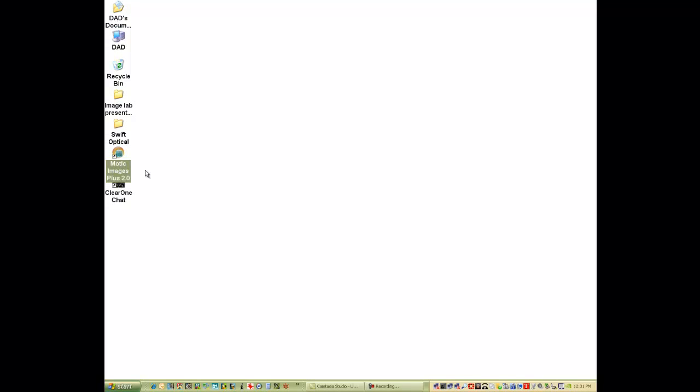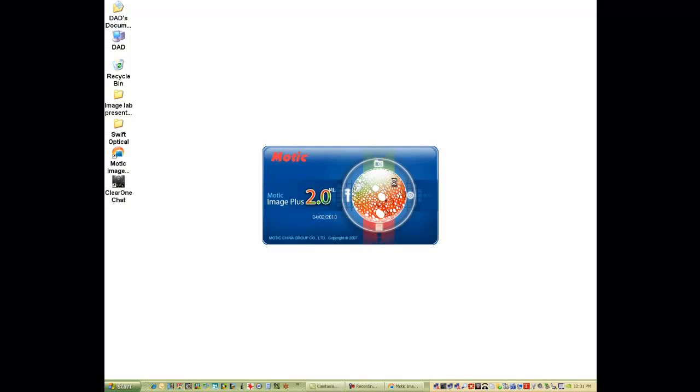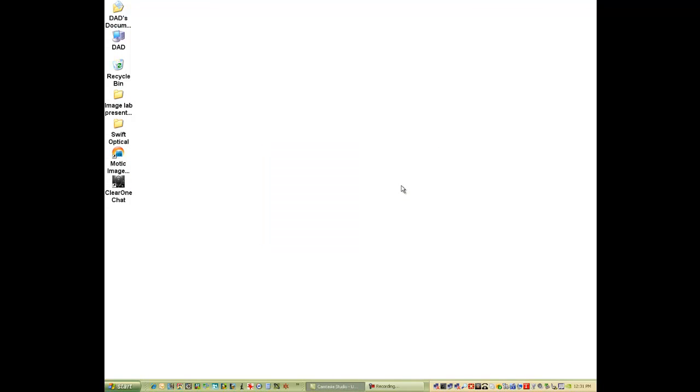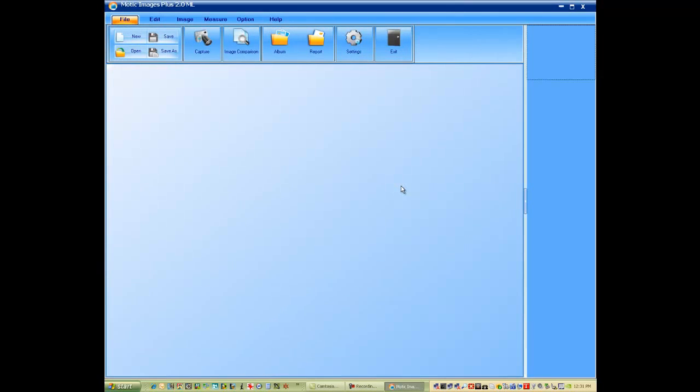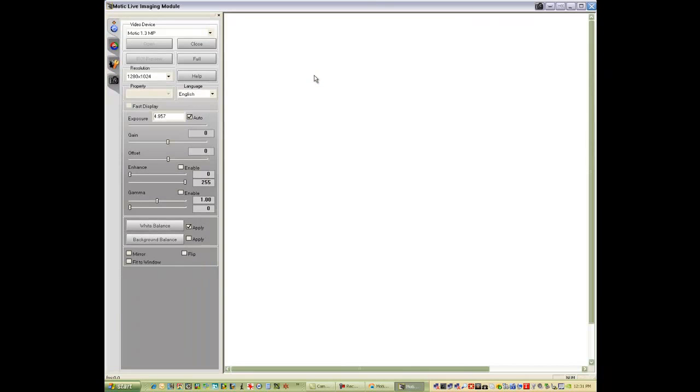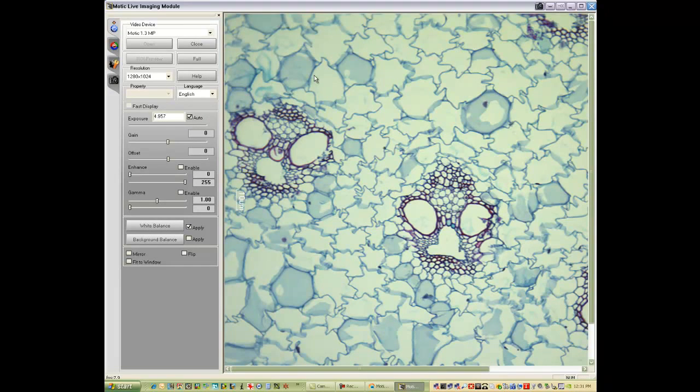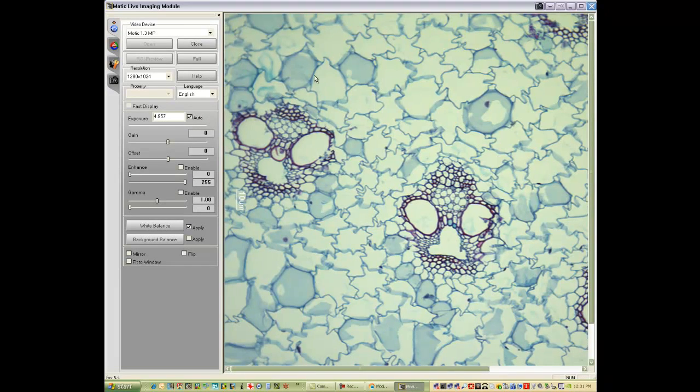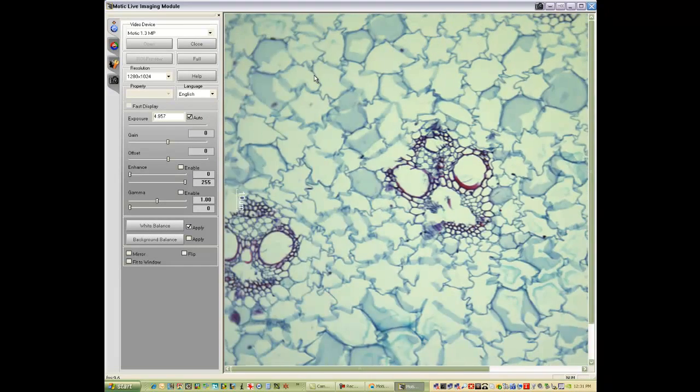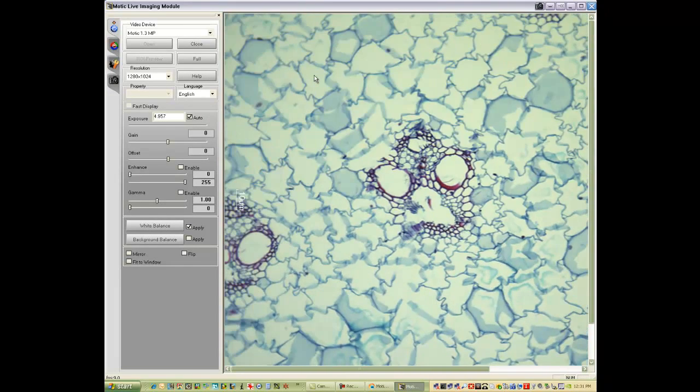Launch Modic Images Plus. Activate your camera icon. This is a picture of xylem tissue.